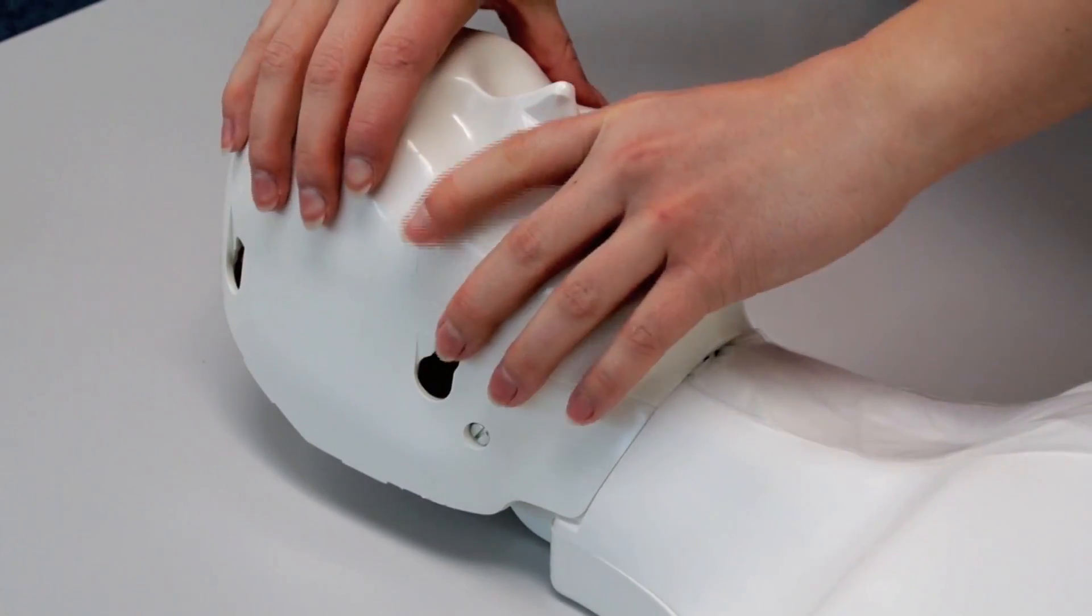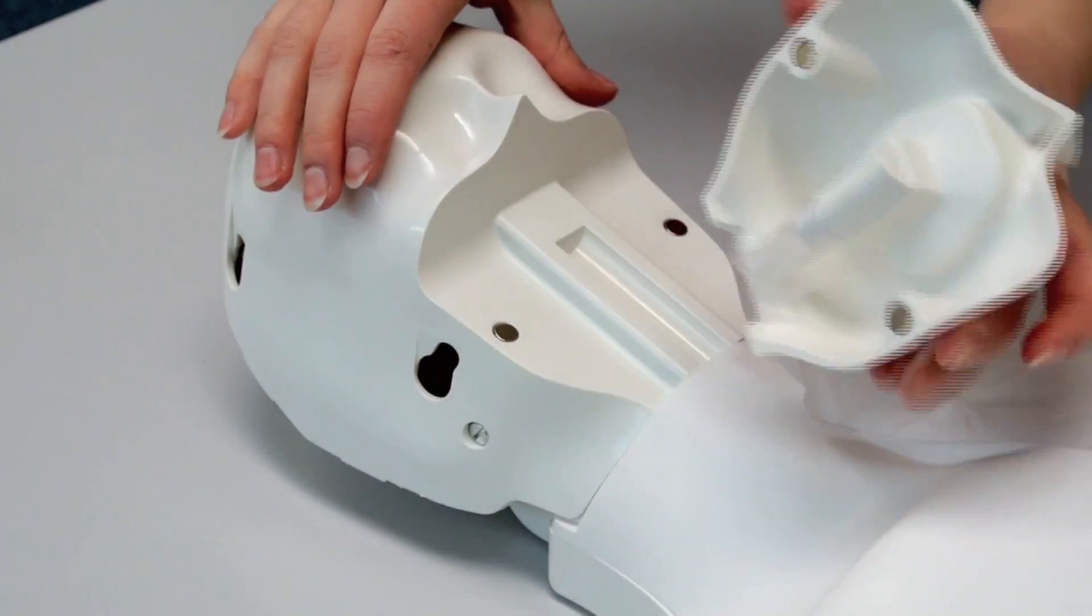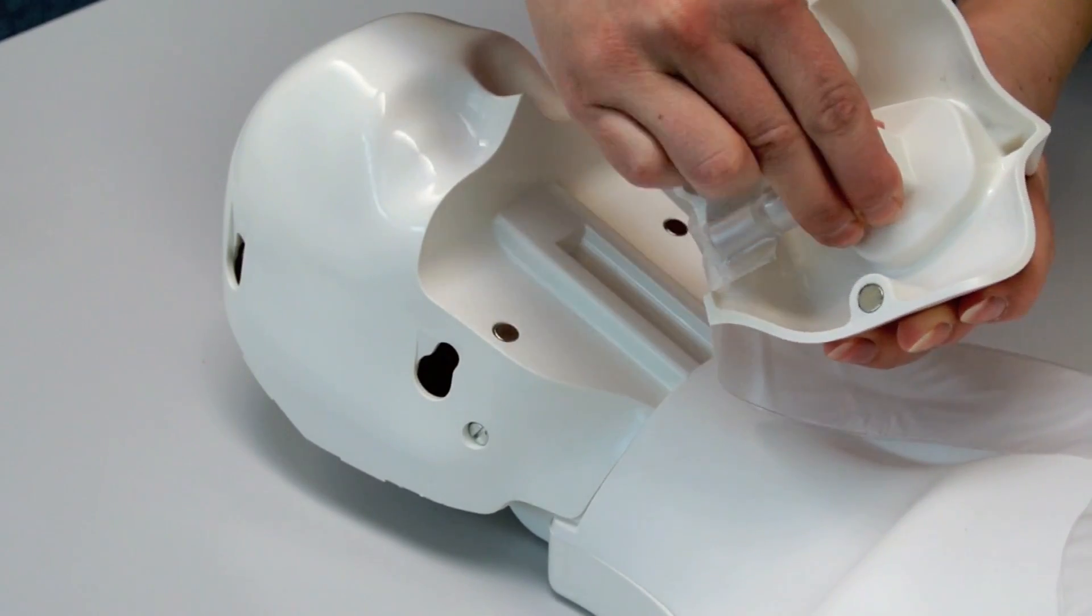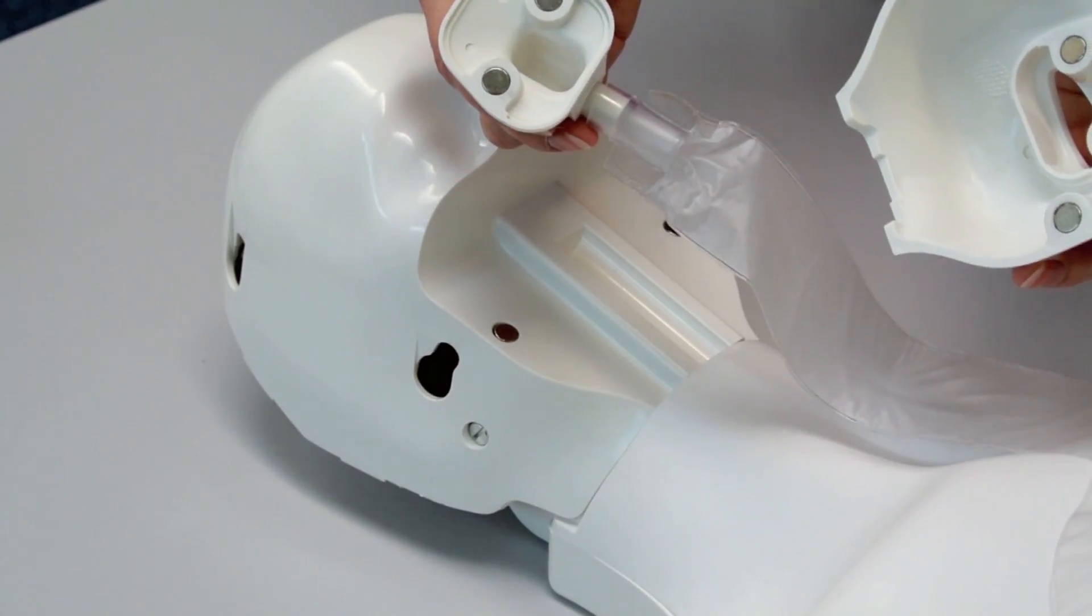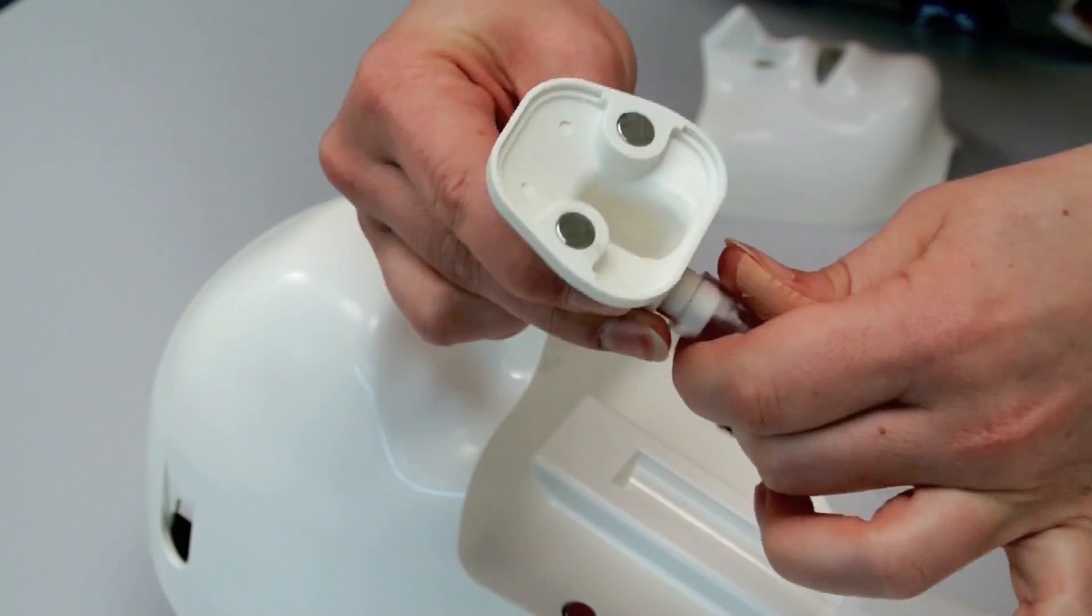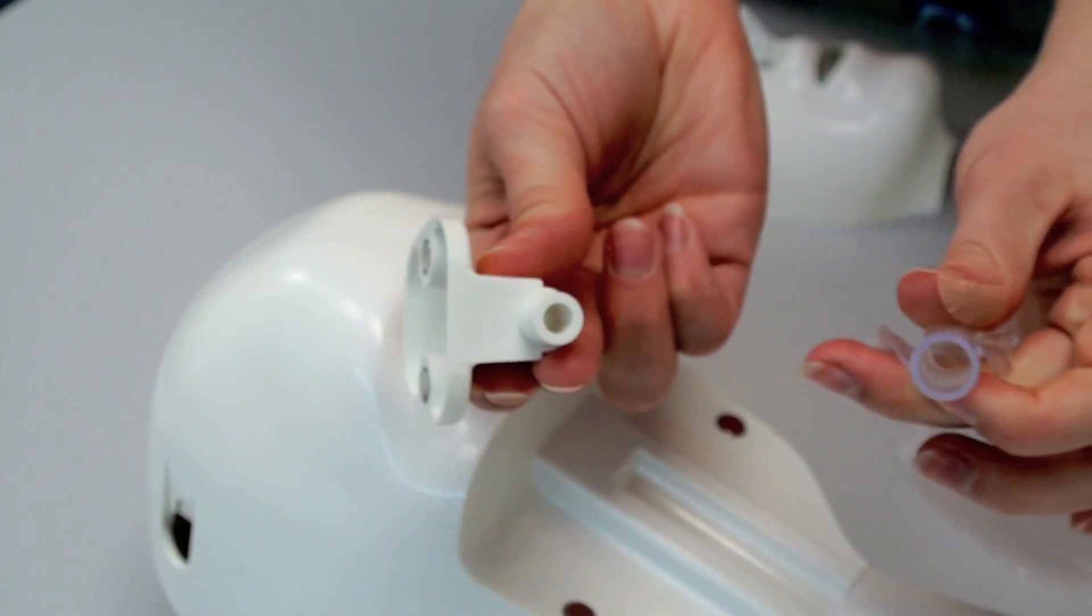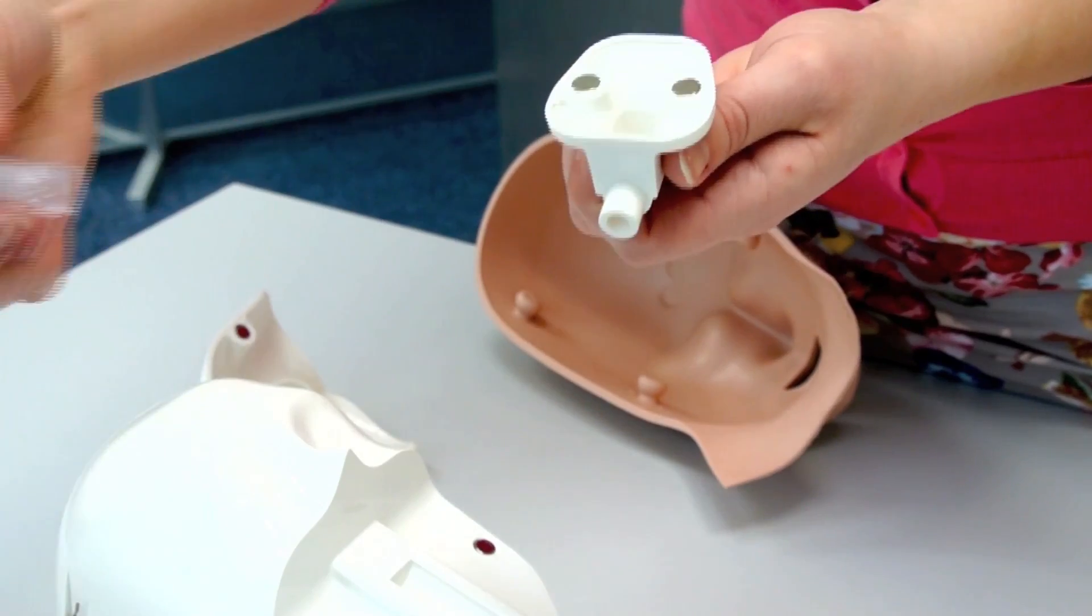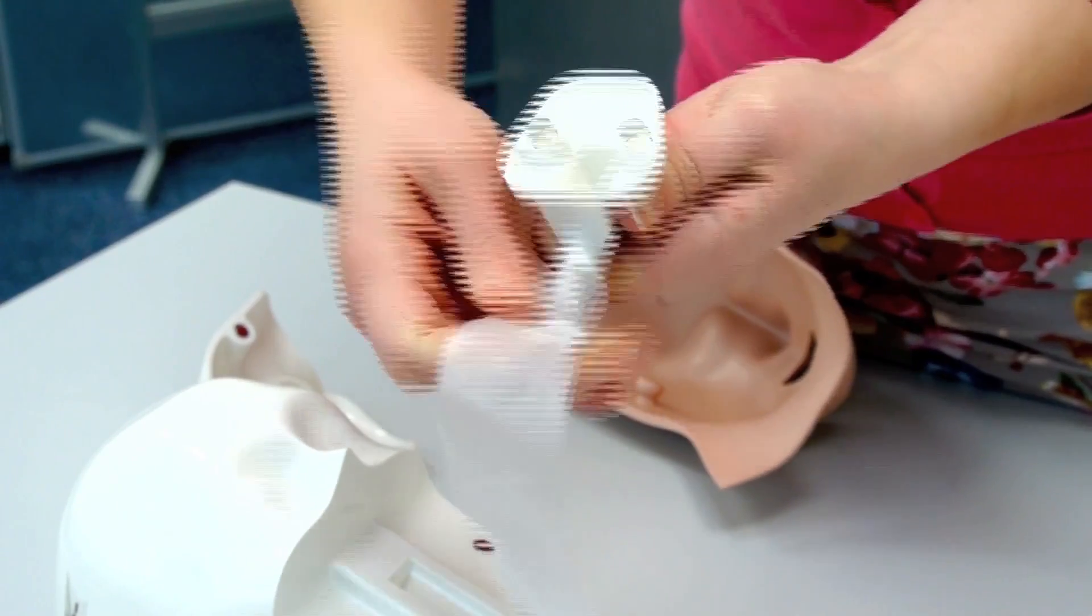To detach the lung bag from the lung bag socket, you need to remove the jaw insert. Replace the used lung bag with a new one, and reattach the lung bag socket to the jaw insert.